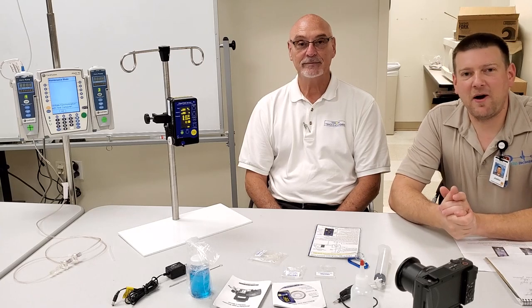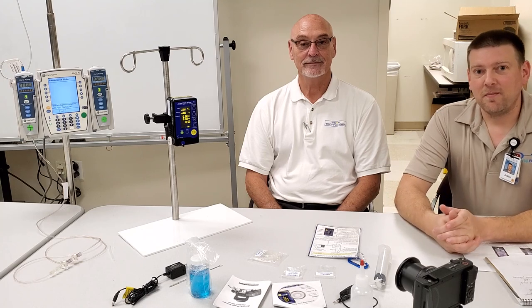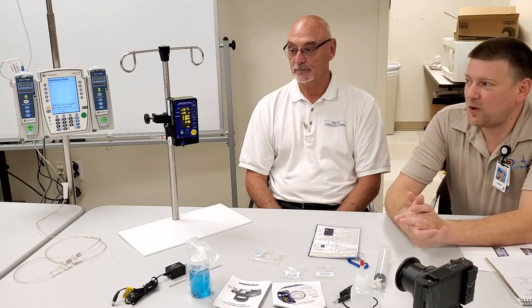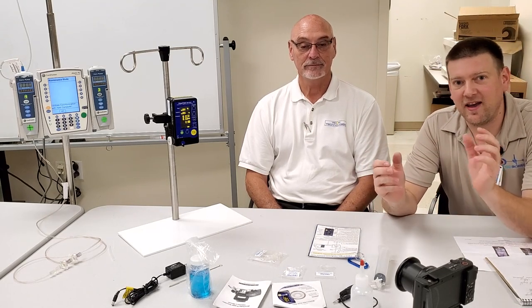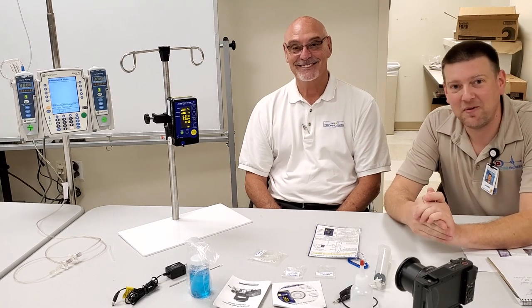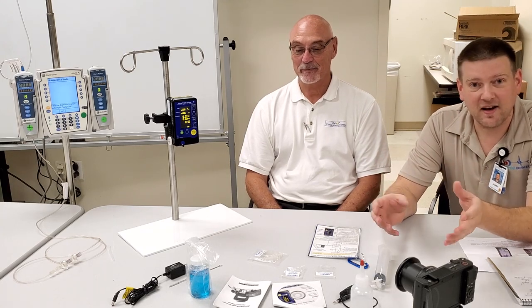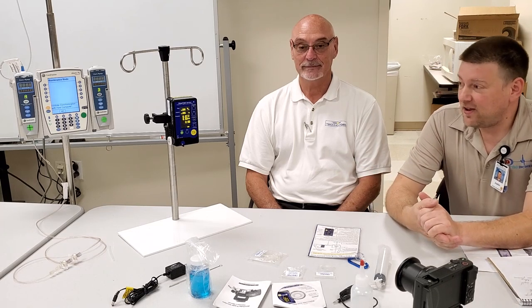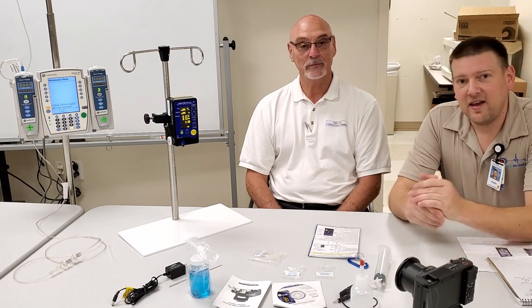Hey everyone, welcome back to Better Biomed. Today I have something very special for you. Paul here from Pronk Technologies has flown down to help me demonstrate the Flow Trax, which is the most complex out of all the Pronk products. I was really afraid to mess this one up, so he was more than happy to come help us out. We're going to go over all the specs, all the details, show you how to set it up, how to run it, and how to clean it.